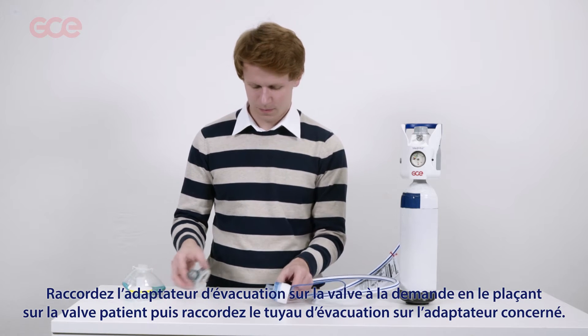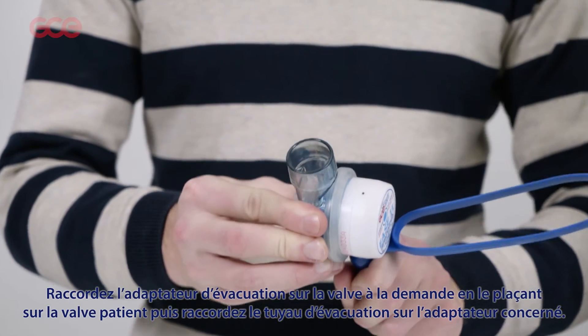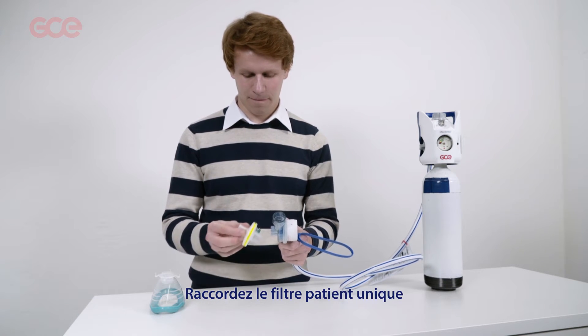Fit the scavenging adapter to the demand valve by pushing it over the patient port. Then connect the exhalation pipe to the scavenging adapter.